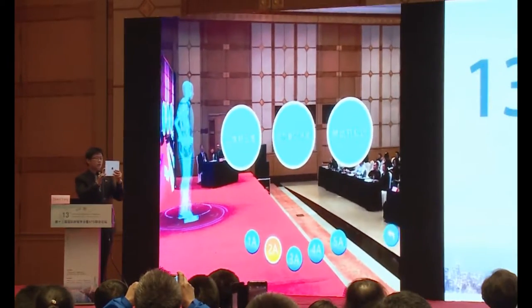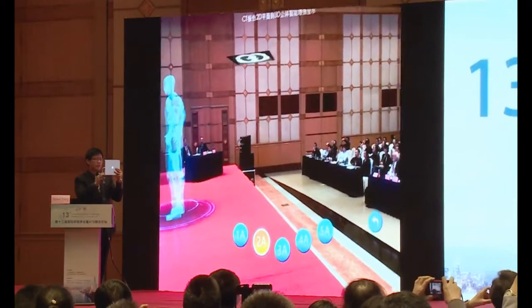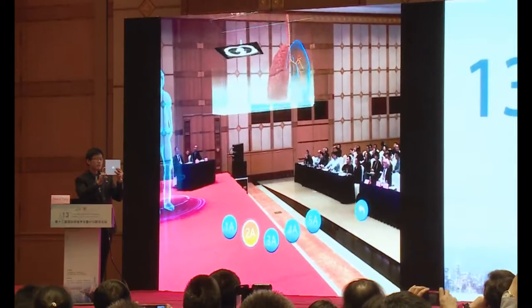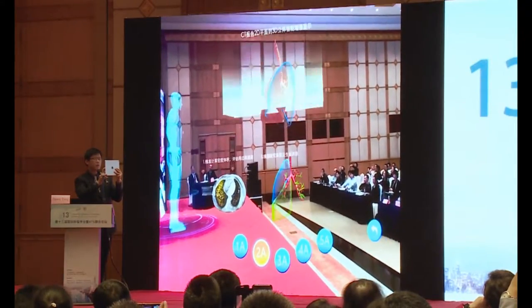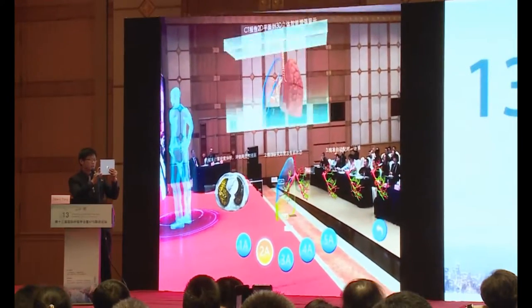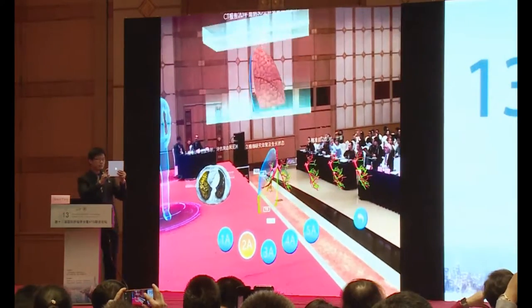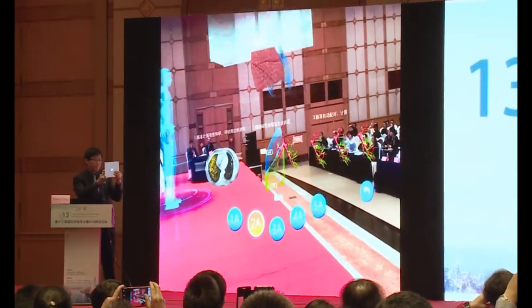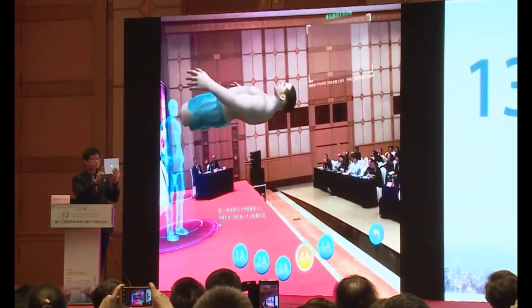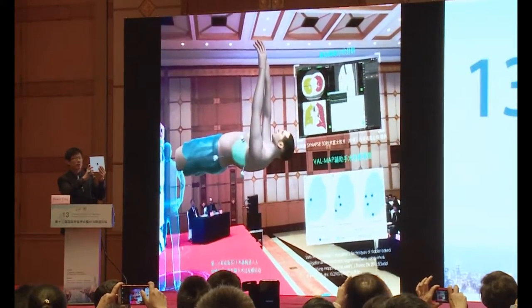So here we will educate the local physician on the meaning of the CAT scan, and even thinner slice scanning. So we have some vivid models to show what we will analyze, like I showed you on the previous slides. So we will see the volume of the nodule, the vessel size, and the bronchus relationship of the nodules with the lung nodule.